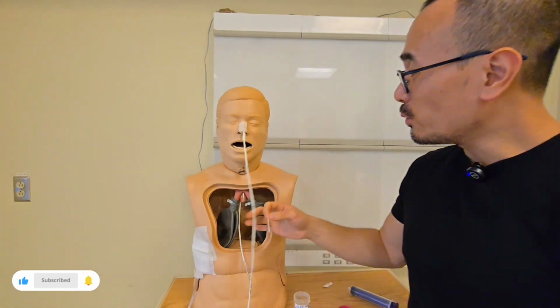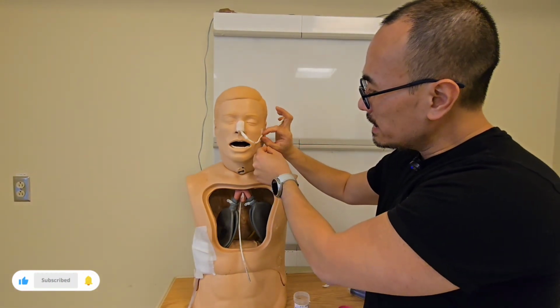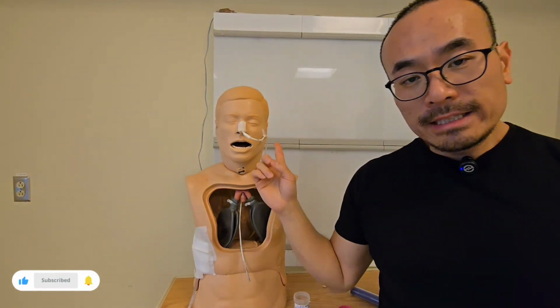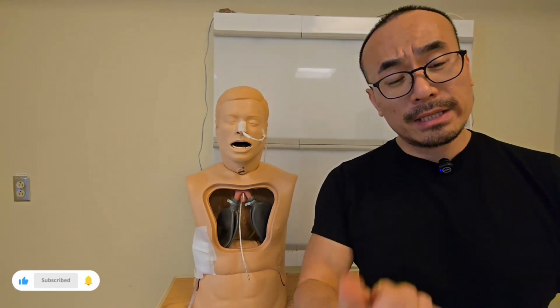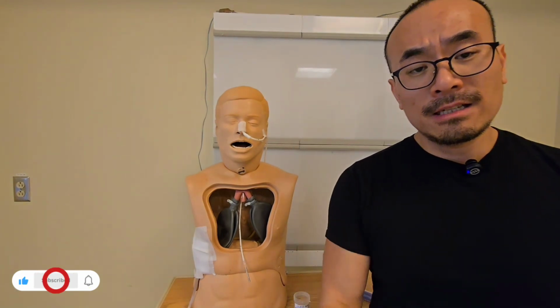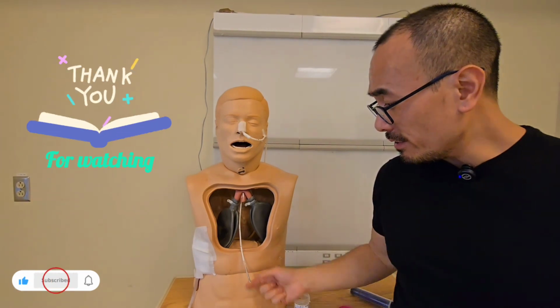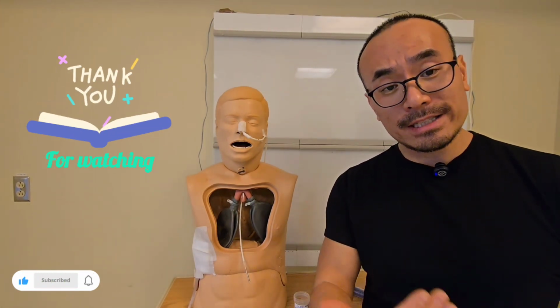Team, before we finish, we're just going to secure the tube to our patient to minimize any tugging. This will also provide some additional comfort for the patient and prevent the tube from being accidentally pulled out. And that is all for our two-step NG insertion for the Enfit type, intended at our institution for feed only.